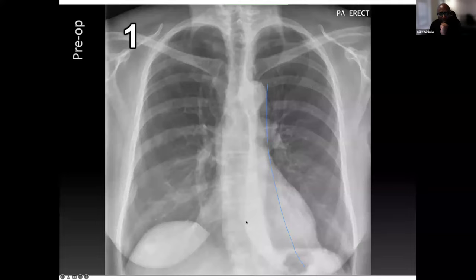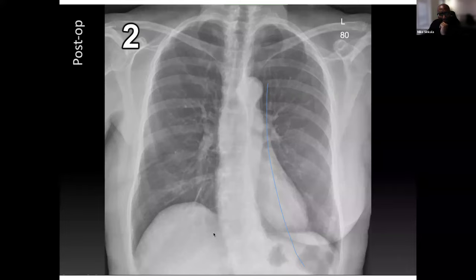And then usually in our lovely ladies, the lower parts of the lungs might be whiter sometimes because of the breast tissues there. And then the upper bit of the same lungs might be a bit darker than the lower bits because of the presence of the breast shadows. Now, notice this: on this patient, we do have the breast shadow on one side here, but we are losing the breast shadow on the other side. So this patient has had a mastectomy done.